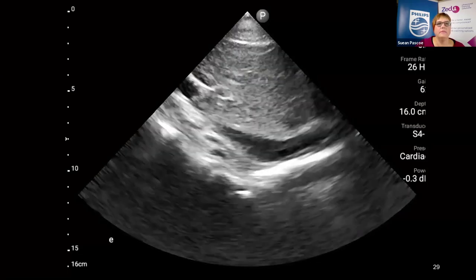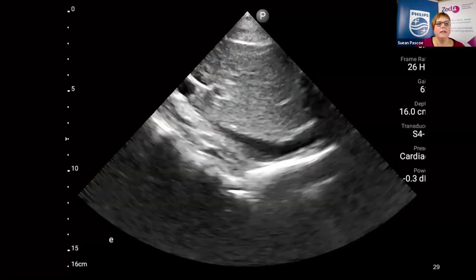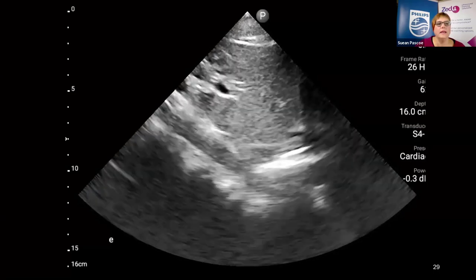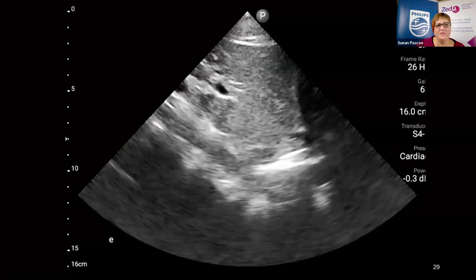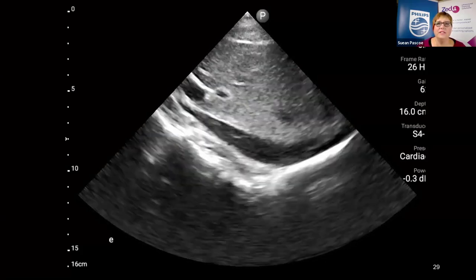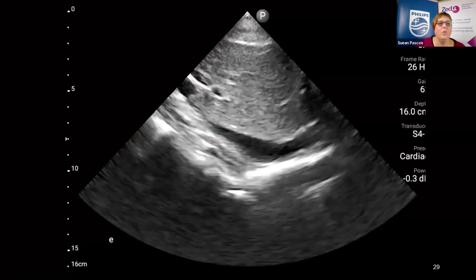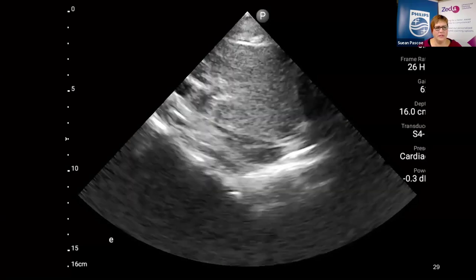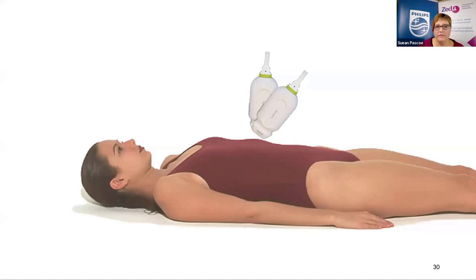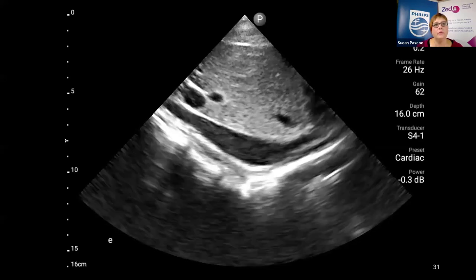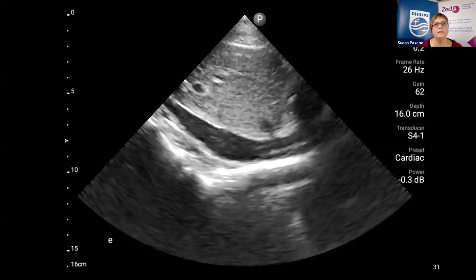The other big tip is to keep the heart on the screen. Make sure your probe is pointed up toward the patient's head enough so that you've got the diaphragm on the edge of the screen and you can see a bit of the heartbeat on the screen edge. If you're pointing your probe to the bed, you're missing the proximal part of the IVC. Here's that movement on a real patient — as we rock up we see more of the heart, rock down we see more of the abdominal part of the IVC.